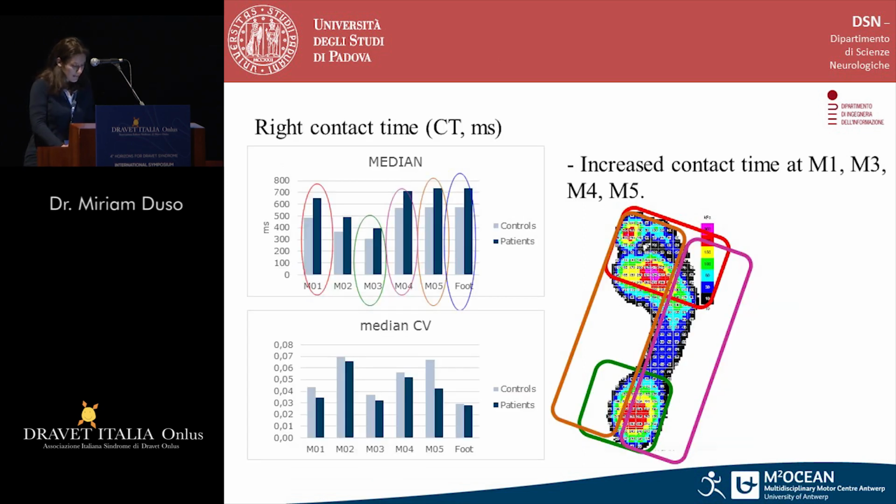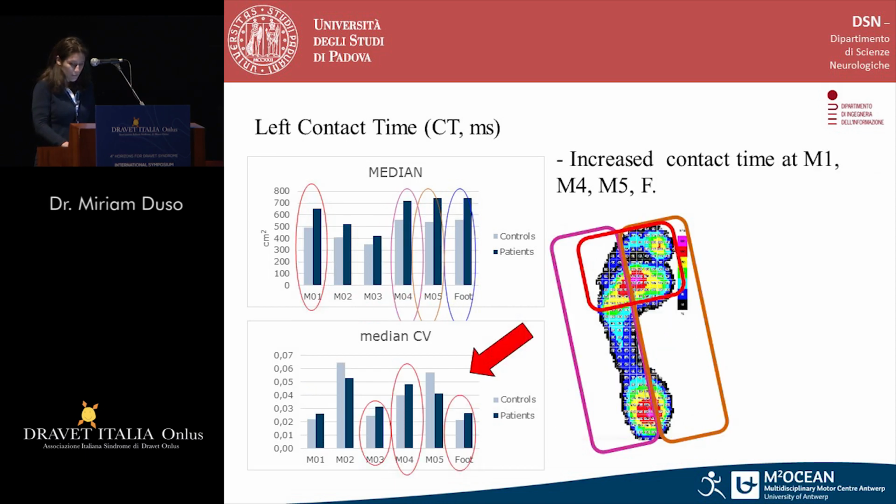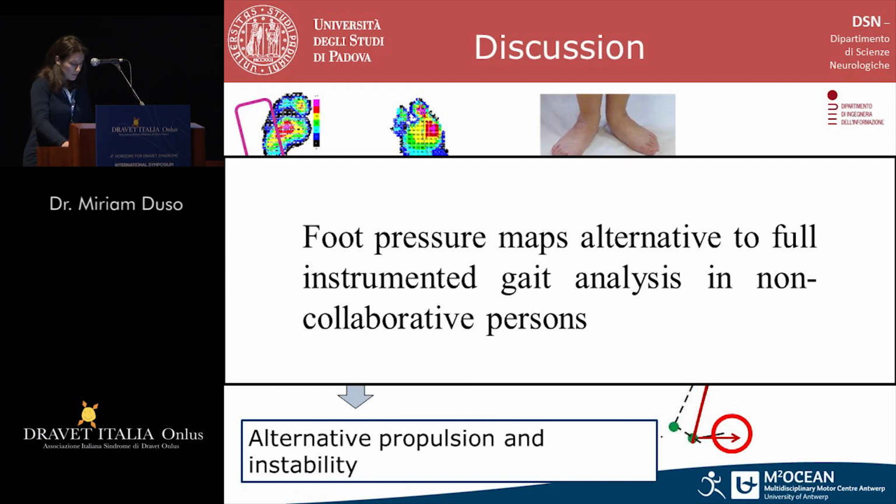As a result, we saw the reduction of the lateral force of the foot, the bilateral reduction of force of the rear foot, and a roughly overall increase in contact time bilaterally. So, the reduction of the lateral force of the foot is associated with a flat foot condition, as we see in the photo, and also associated with a reduced rear foot force.